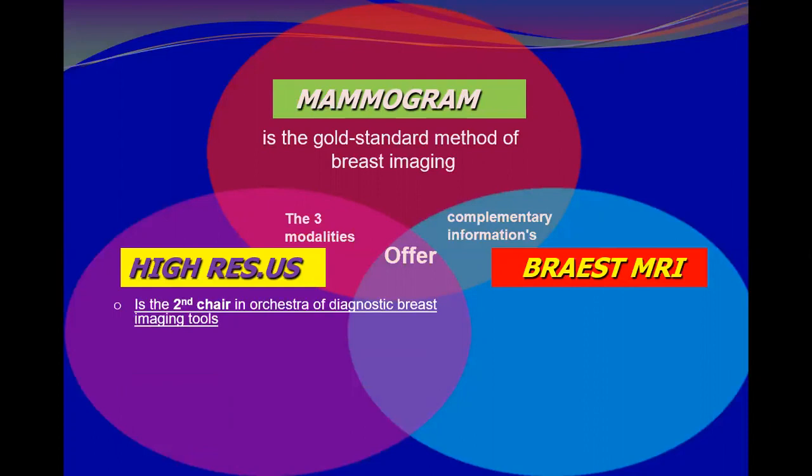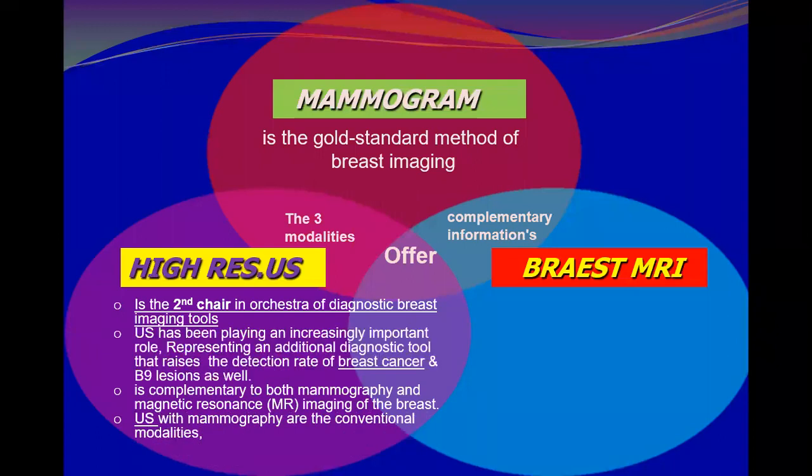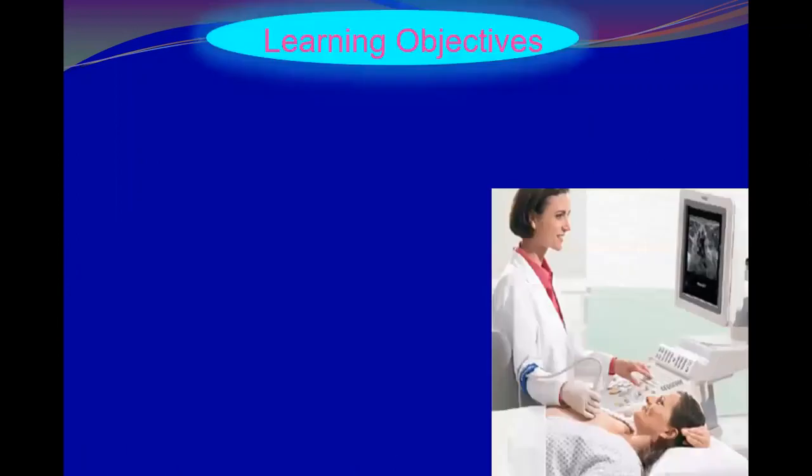And as you know, it is a second chair in the orchestra of diagnostic breast imaging tools, and along with mammography, representing the conventional modalities, is complementary both for mammography as well as for breast MRI. Ultrasound has been playing an increasingly important role, representing an additional diagnostic tool, raising the detection rate of breast cancer as well as benign breast lesions.